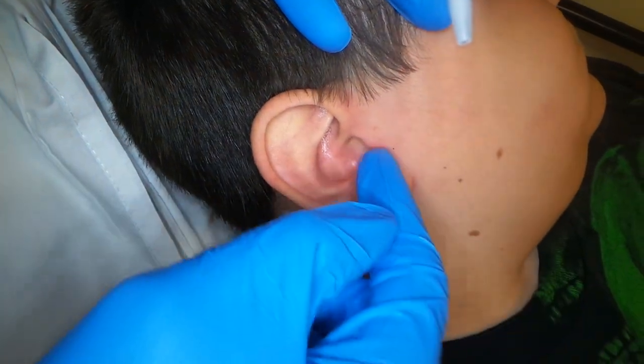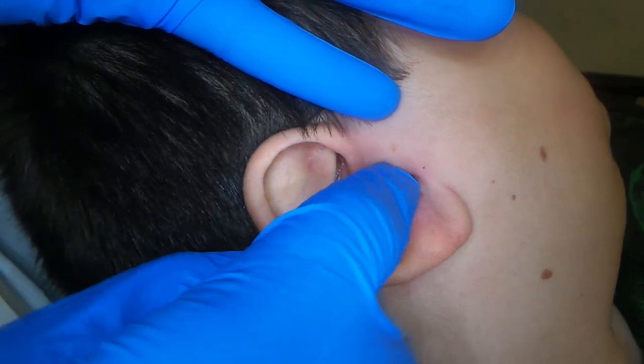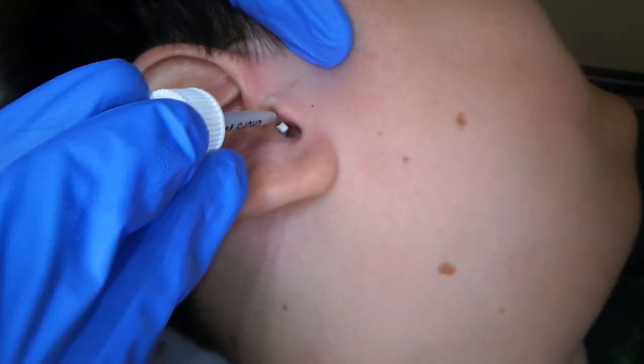It's in there. Turn your head just a little bit more. Push that down in there, just on down. There you go. Now let's go ahead and put the drops in.